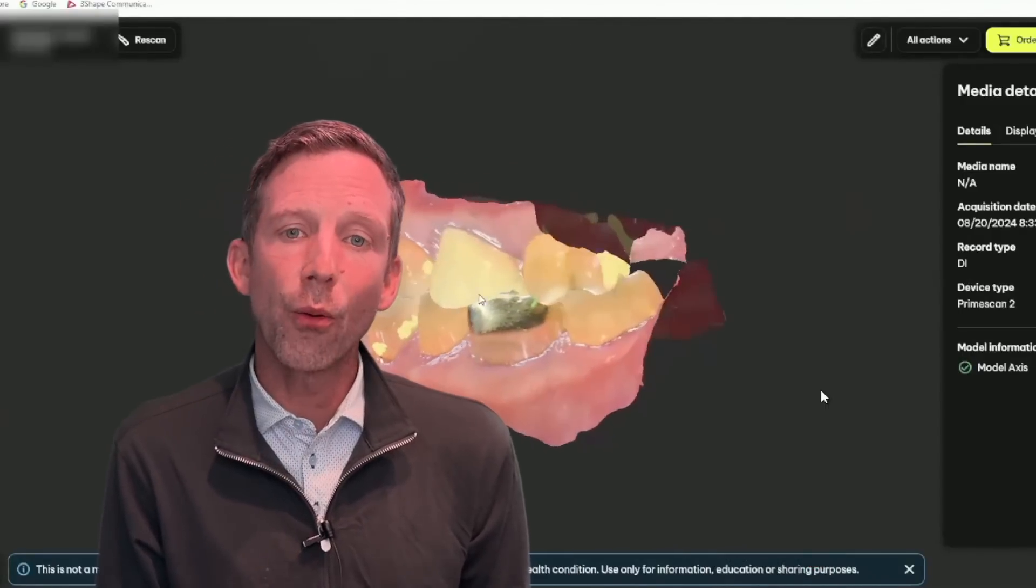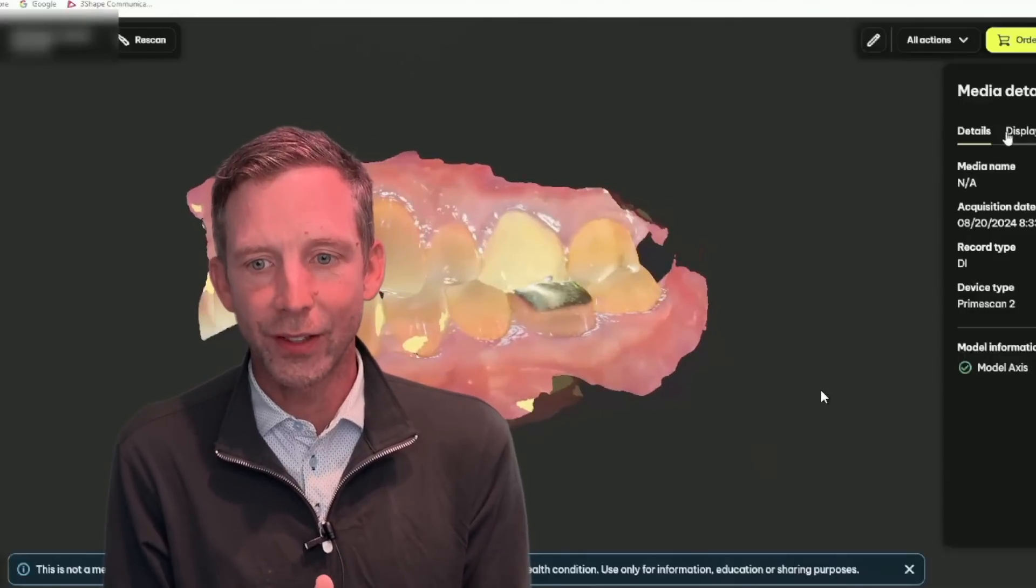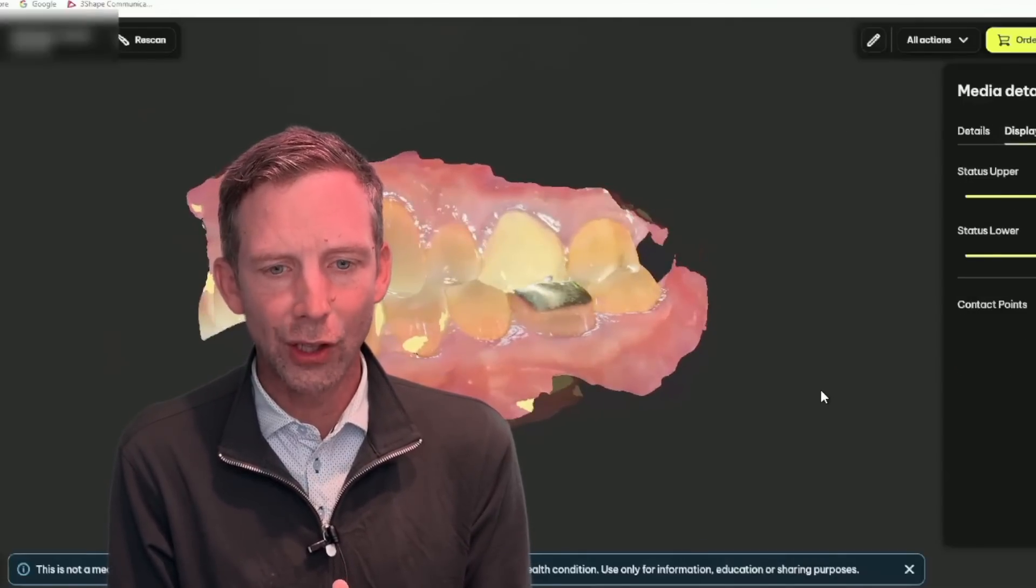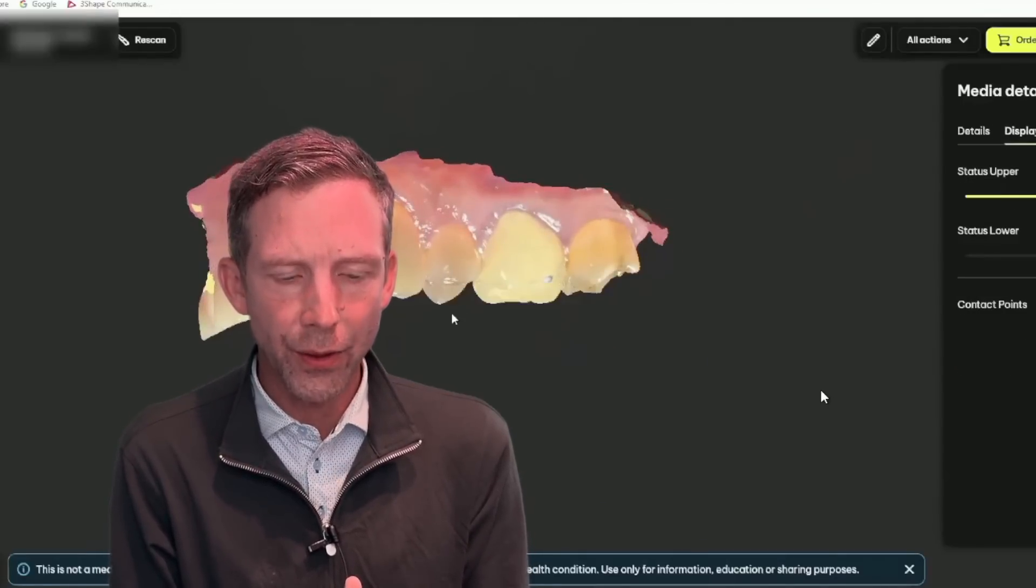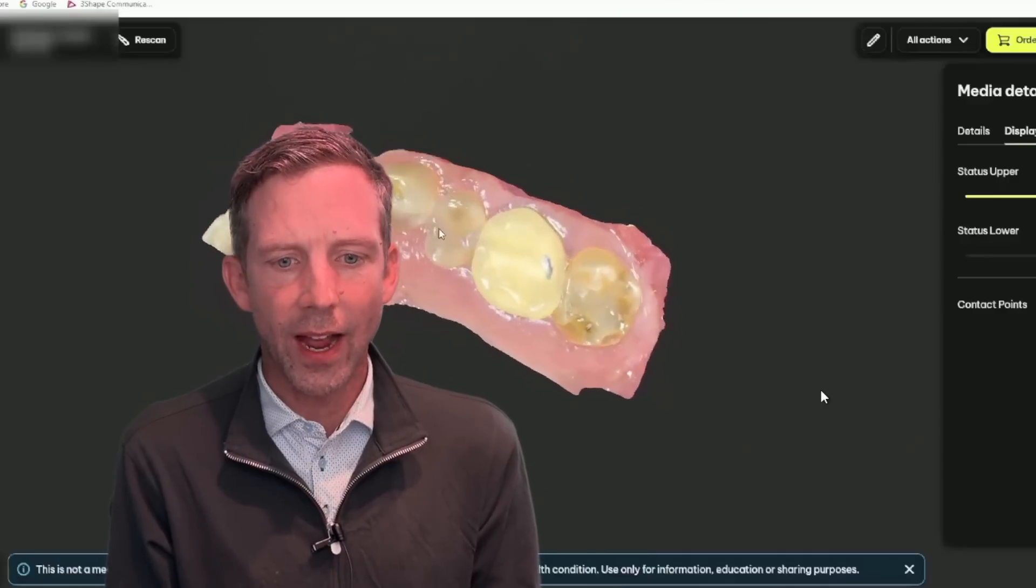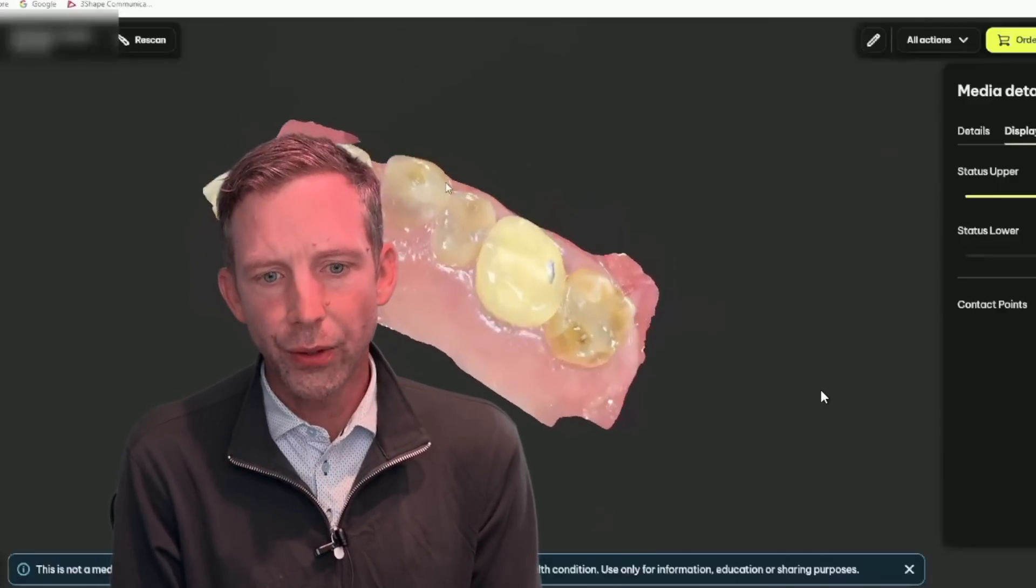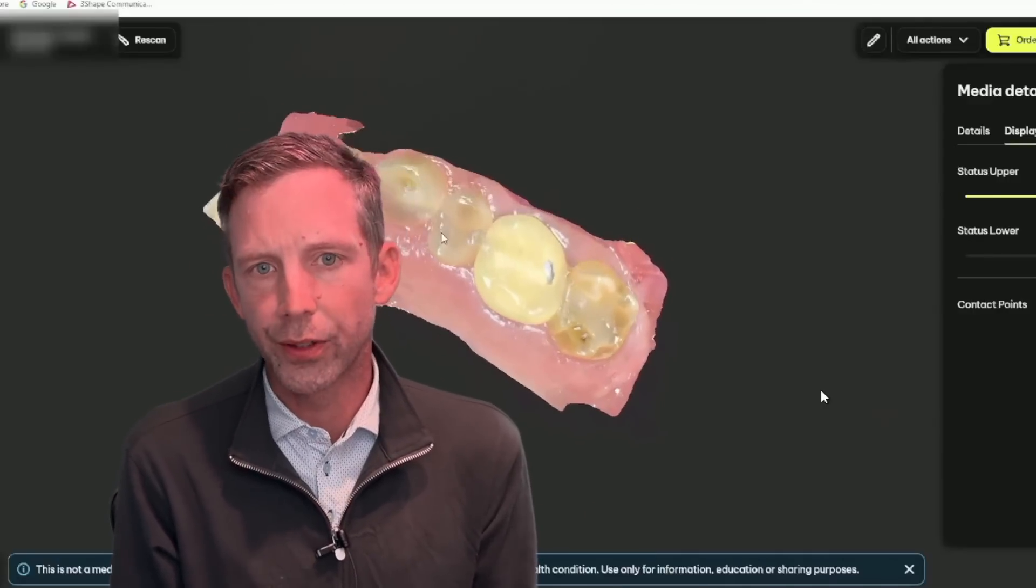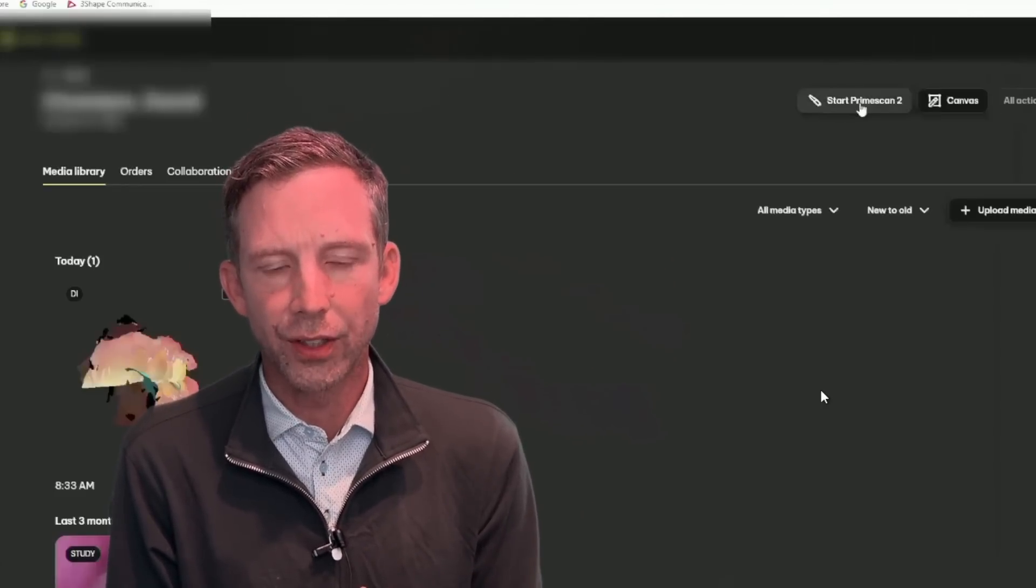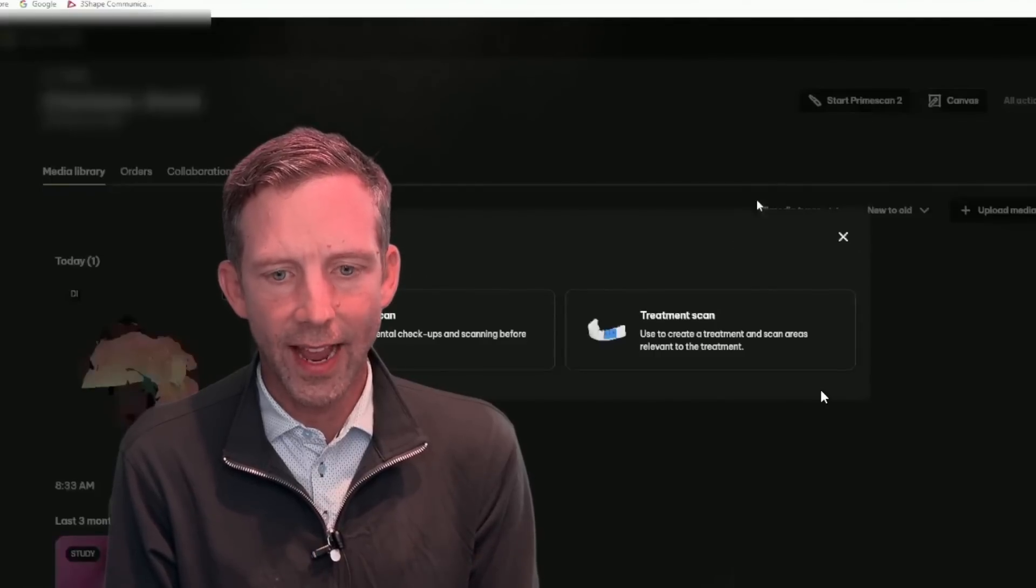So now we went ahead, let's say we prepped this tooth. So we're just looking at what this looks like in the viewer. You can see that we have the broken down tooth if we wanted to show the patient what we're doing. But mainly it's just for getting the initial scan.